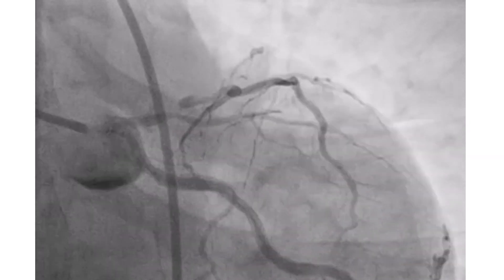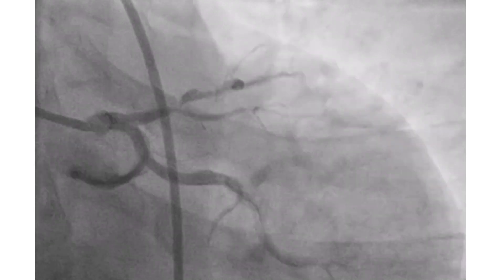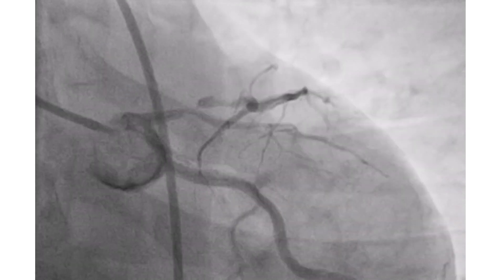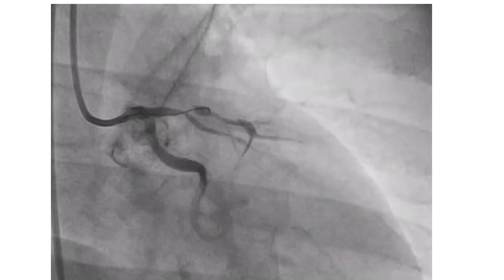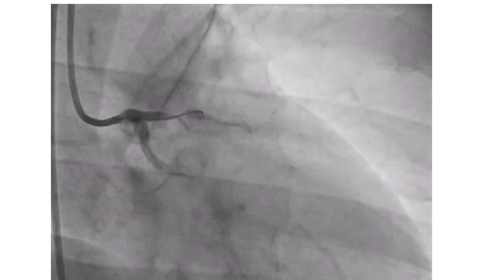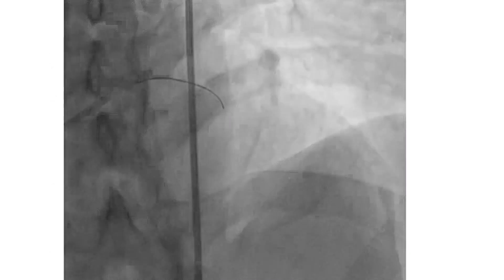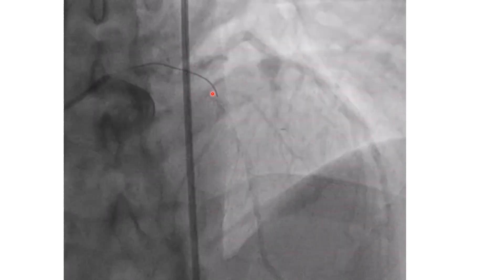Look at this angiography of a patient with ACS. There are two proximal LAD critical lesions with some haziness. The same is seen in the cranial view. In the caudal view, the wire passed the proximal part and it looks intraluminal. However, it was not progressing. The cranial view showed that the wire is stuck inside the plaque.